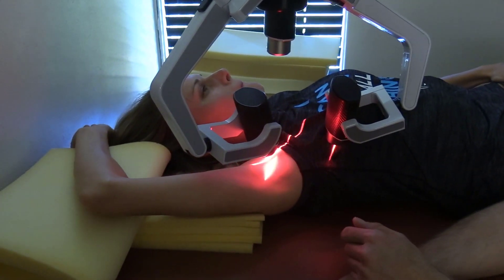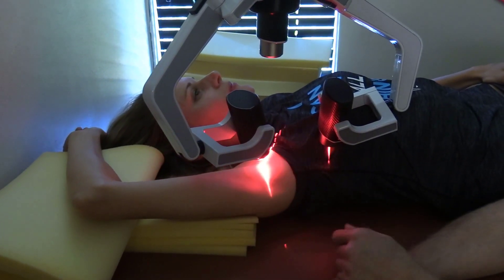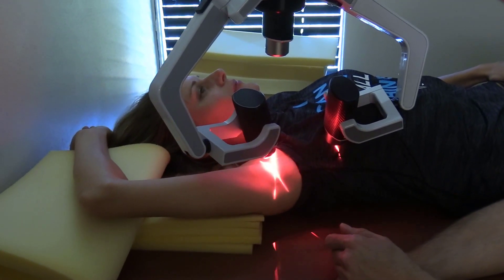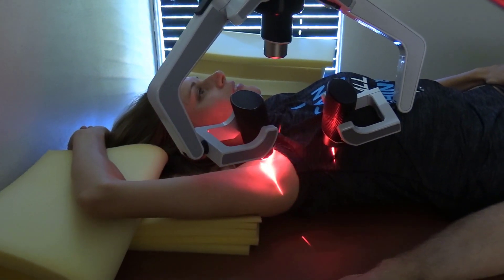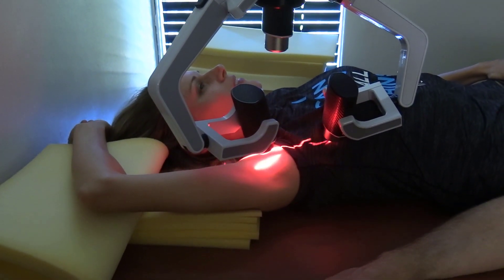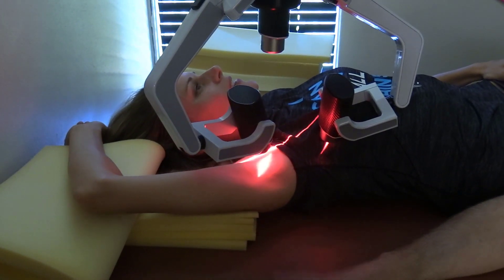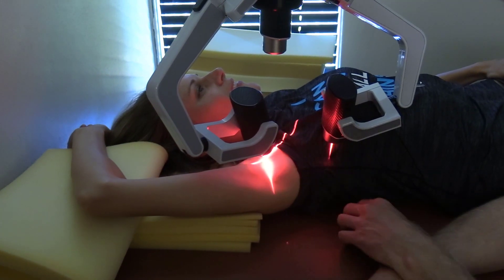It's nice to give people a break and let them feel what it's like, so they realize it's working. Because honestly with the lasers, the biggest hurdle you've got to get over is the person's got to believe that they're going to work. In the beginning, that is really all you're fighting for — you've got to show them some type of change so that they realize these lasers actually work. It's what I wanted to know before I bought them; it's what everybody wants to know before they spend any money on them. So you've got to show them that they're working.